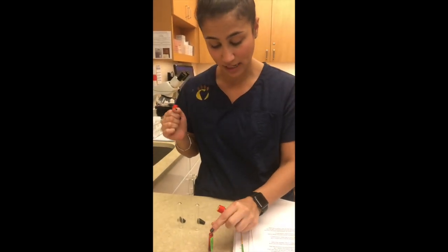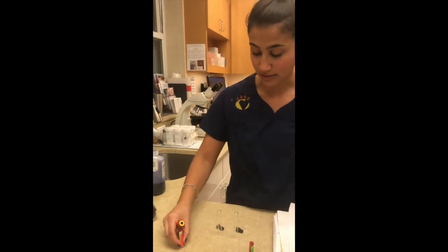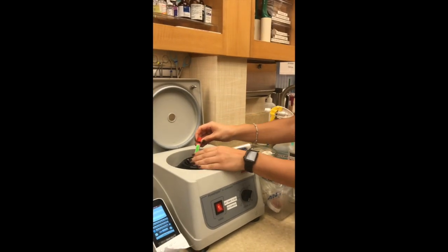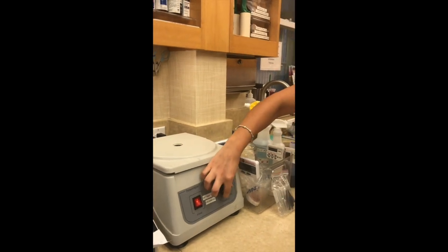Okay, so we're going to start our cross-matching now. I have our donor blood, with our EDTA tube and our serum separator tube, and our recipient with our EDTA tube and our serum separator tube. First I'm going to spin our serum separator tubes in the centrifuge just to get our serum. Put both in there. Great. I'm going to start it at 5 minutes to get our serum.